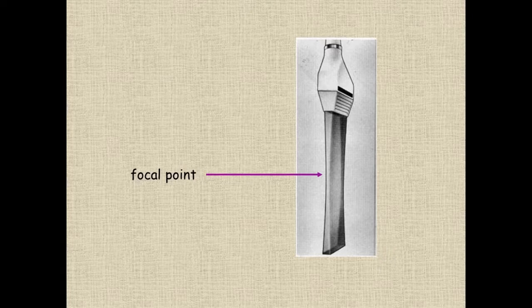We can influence this by adjusting the focal point to coincide with the depth of the structures we're interrogating, and many modern ultrasound machines have one or more focus points that can be adjusted as little arrows on the side of the depth scale, and can markedly improve the image quality when manipulated to coincide with the depth of the nerve to be examined.